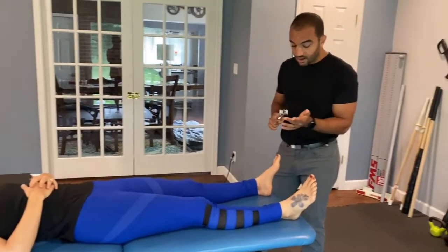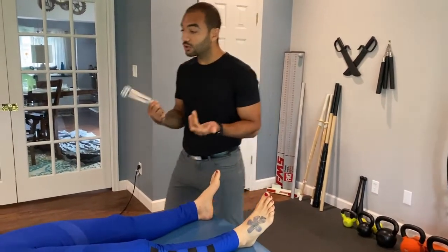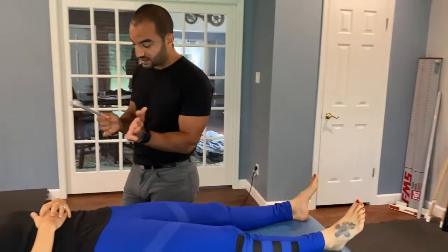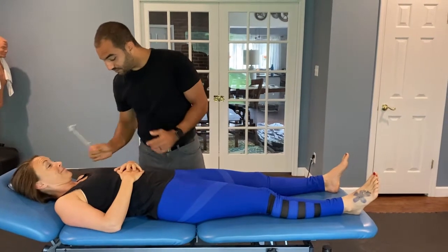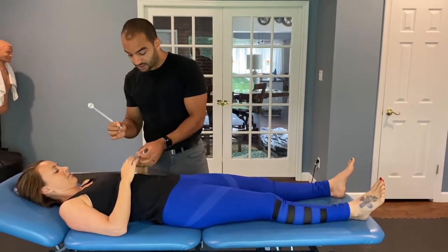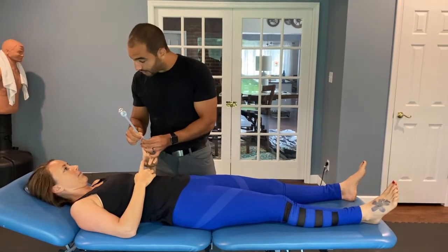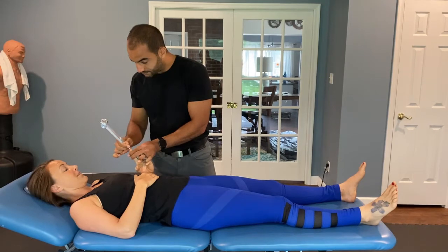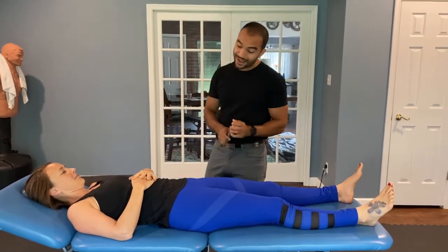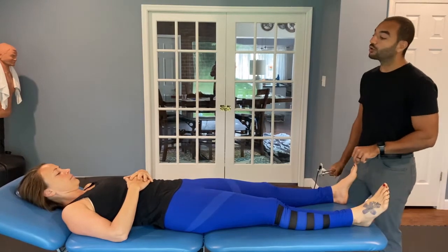So with that, I'm going to basically ask the patient, Sam, I want you to close your eyes. Here's what this basically feels like. Okay, I'm just going to put this on your cheek so you can feel. You feel that vibration? Good. I'm going to also give it to you at your finger. Do you feel that vibration? Okay. And you feel how this is not vibrating? Yeah. You feel how this is vibrating? Yes. Okay. So I'm going to have you close your eyes, and every time I touch your big toe, I want you to tell me, is it vibrating or not?